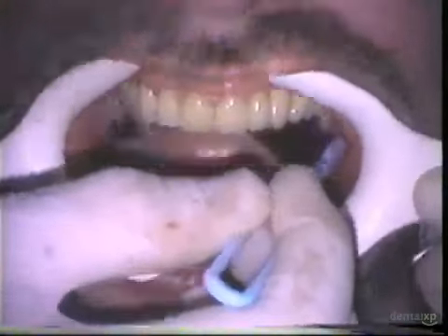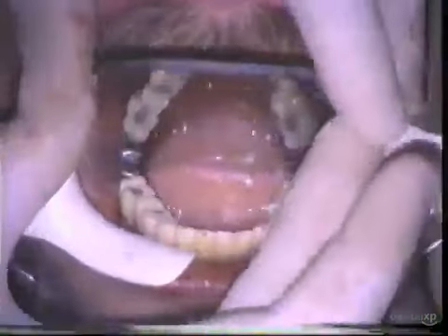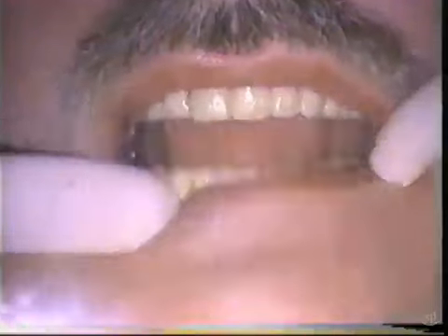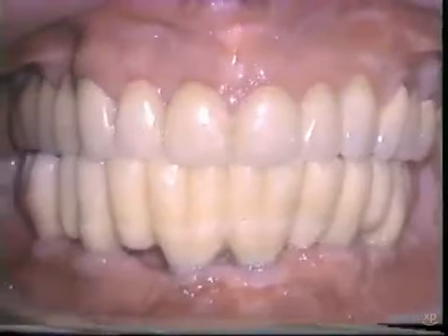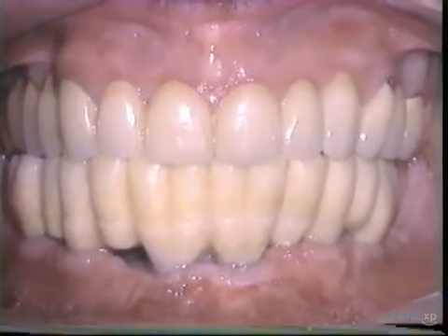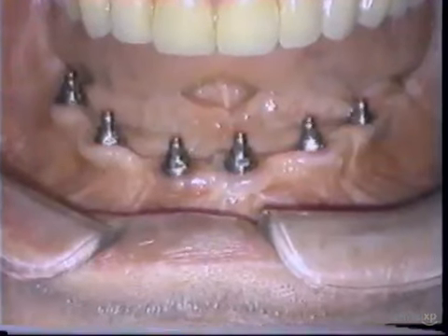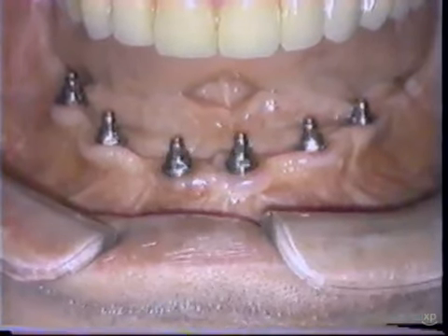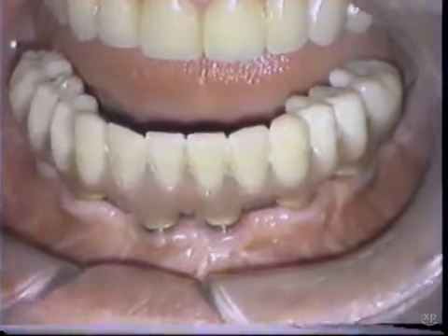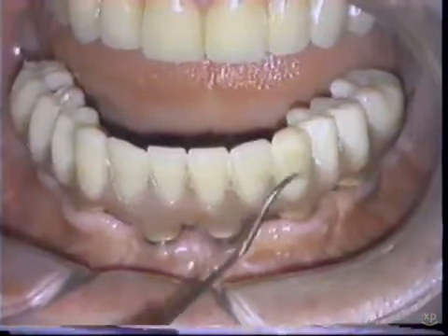We want to create at this time a balanced occlusion so that you have at least one balanced contact when the patient goes on excursions. And you can see the implants are properly distributed for good function and good loading. Here you see the patient come back at six weeks. The tissue has healed well. The occlusal relationship is stable. And at the second visit, we put on our final abutments — these are aesthetic cones for 3i — and also the final restoration that was fabricated on the articulator from the initial impression done at the time of surgery.